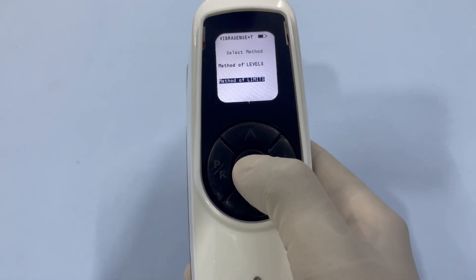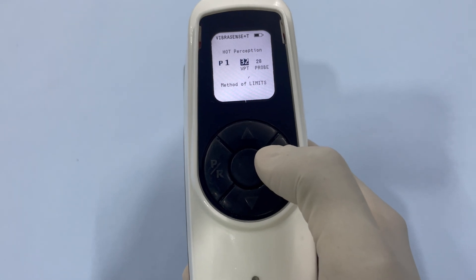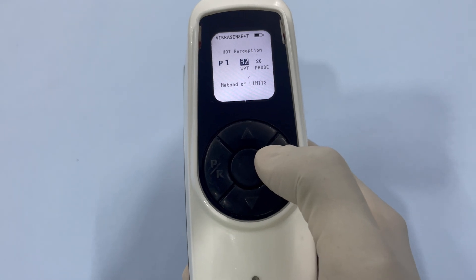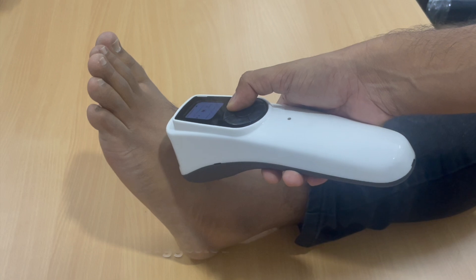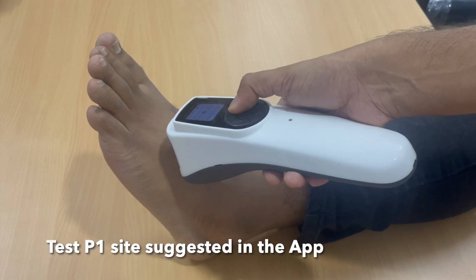Then select the method of testing. This is the warm perception test screen. The default position will be P1 and WPT will be set to a baseline of 32 degrees Celsius.